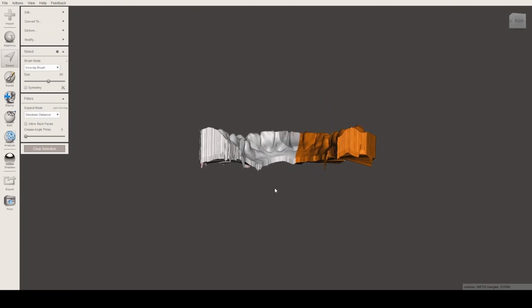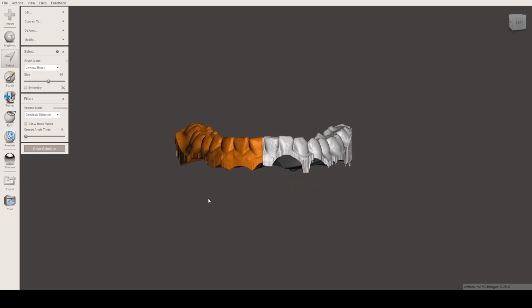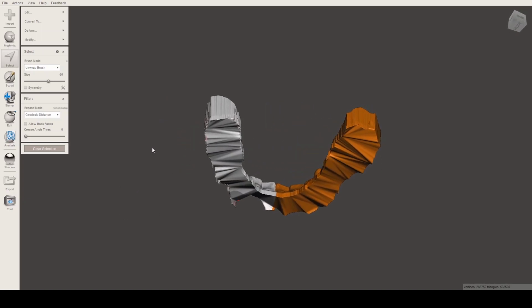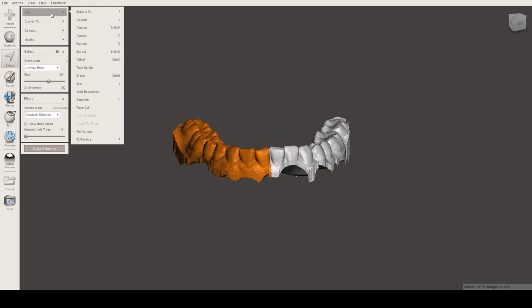Actually, let's select the half of our object right here, and then I'm gonna show you how to duplicate an object. So let's just select it properly. There you go. Okay, I won't be a detail Nazi now, since this is not my major as well. But after selecting it, you can go to edit, and then click separate. What this will do is divide this whole model, this object right here, into two objects. Click separate. It might take time again, as I said earlier.